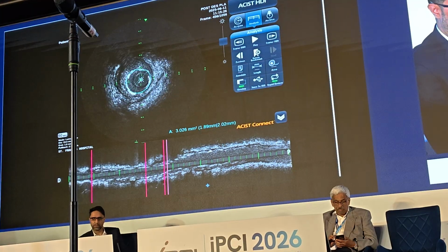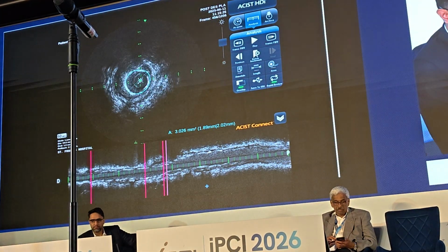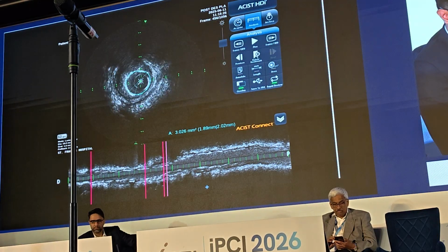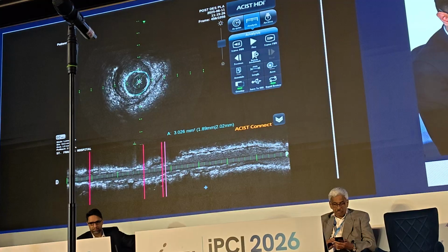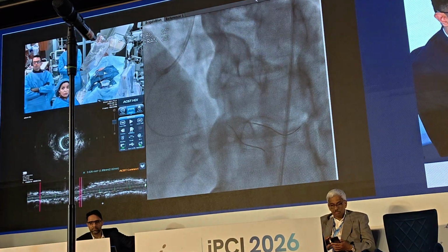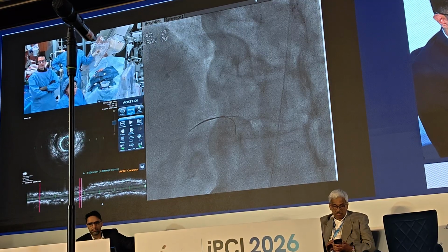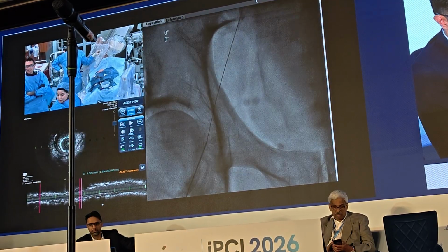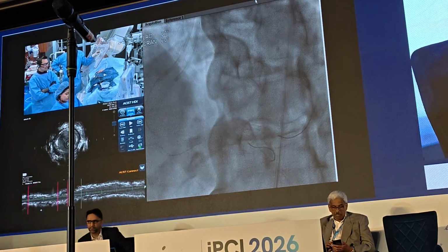But Evan and I had one other problem, right? And that is we put this stent, go back to the angiogram, right across that branch. And so the question is, we don't know whether or not we pinched that branch or not. So can we have the angio back? So what are our options? Option one, take an angiogram, give some additional contrast, see if there's any pinch, see if there's any distal edge dissection, or significant residual disease.